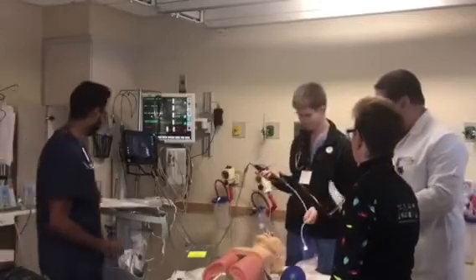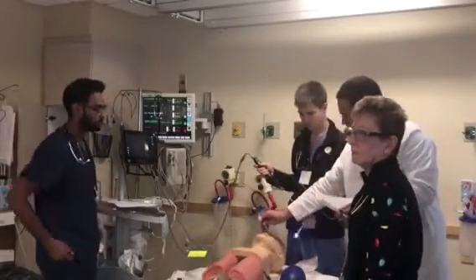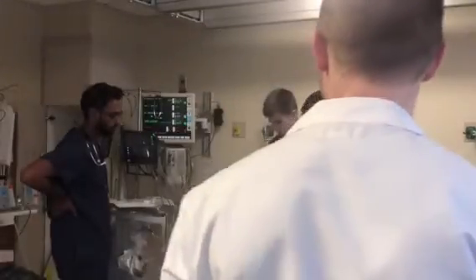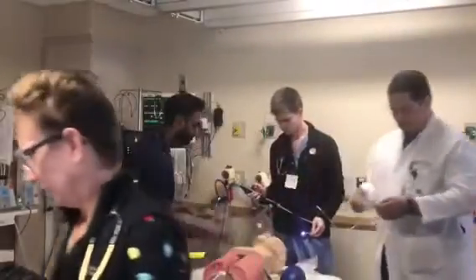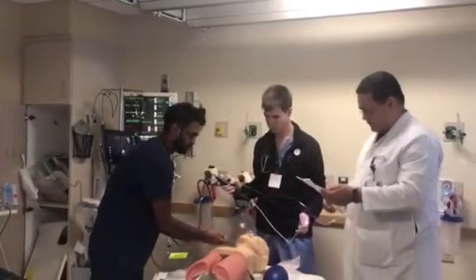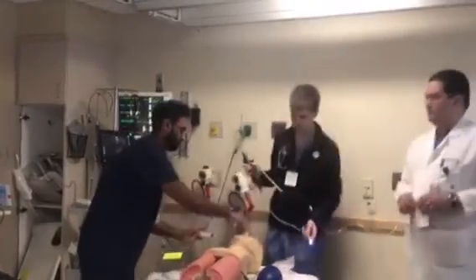Okay. All right. So we have a different scenario now, Professor. You're preparing the fiber optic intubation. Deflate this, please. Ready? So deflate and take the tube out. Okay. So now you're preparing for this, and the patient starts vomiting. What are you gonna do?